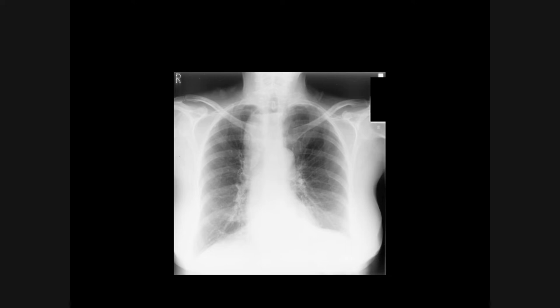This is a patient who has achalasia. You can see that the mass lesion, in this case the dilated oesophagus, is very well defined below, at and above the clavicle. Note also the presence of an air-fluid level. Whenever you see a chest radiograph with achalasia, always have a look at the lung bases for evidence of aspiration pneumonia.